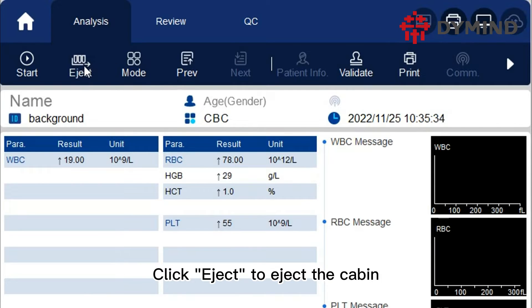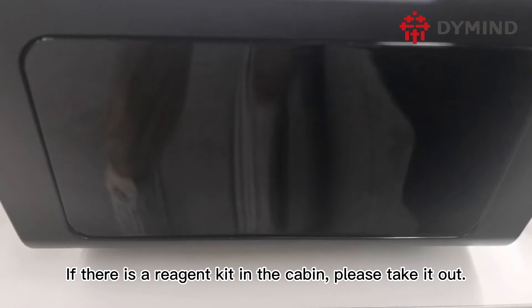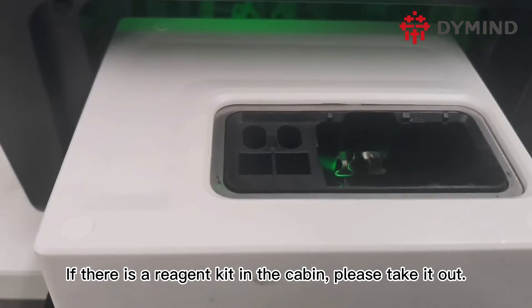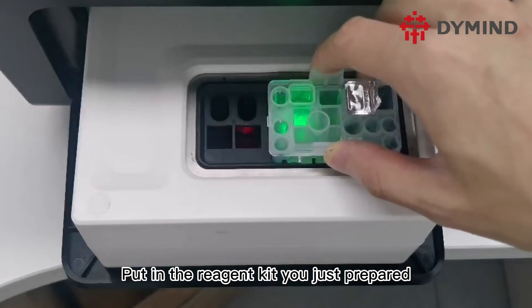Click eject to eject the cabin. If there is a reagent kit in the cabin, please take it out. Then put in the reagent kit you just prepared.